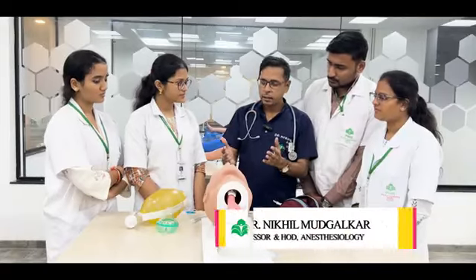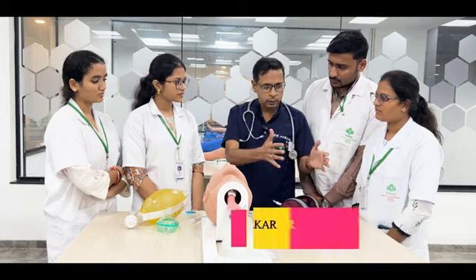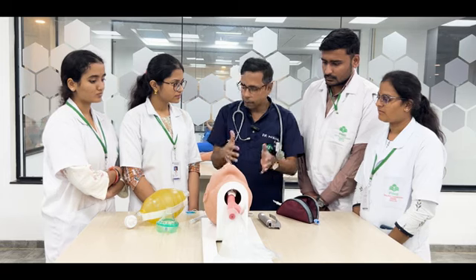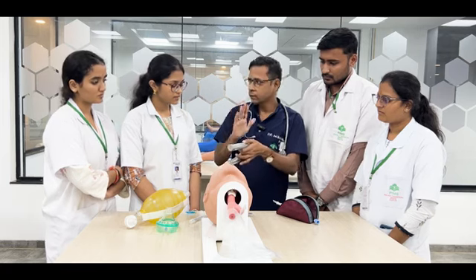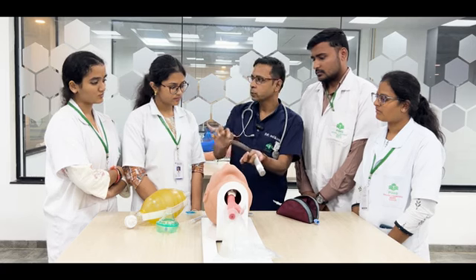Once I decide that I want to intubate this patient, the first thing that I need to do is, wherever I am, come to the head end of the patient. So I am coming towards the head end. This is a laryngoscope. I'll take the laryngoscope in my left hand and I'll open it and see that the laryngoscope is working, the light is coming.